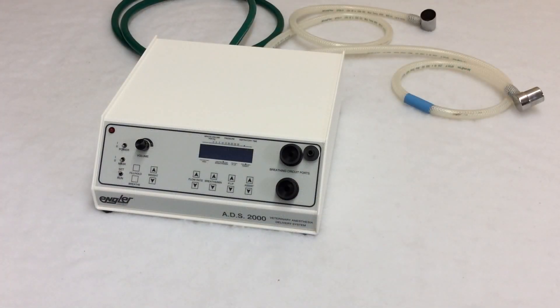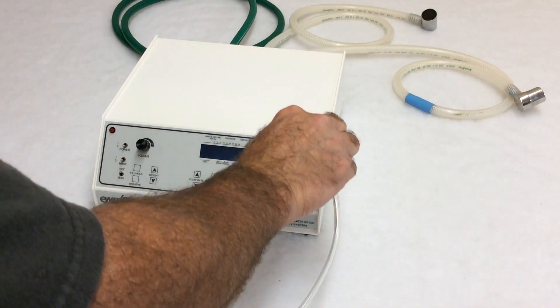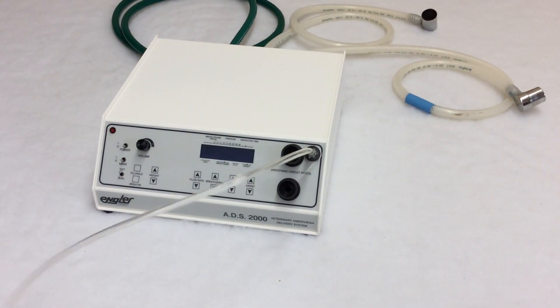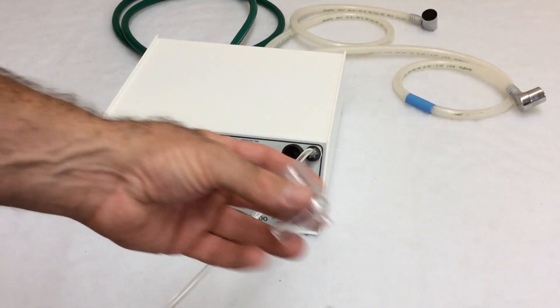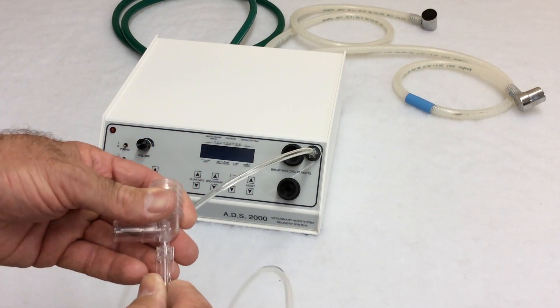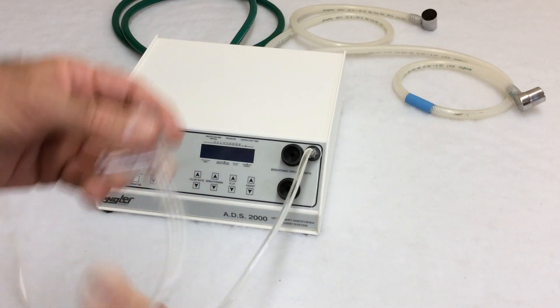Connecting the front of the ADS is just as simple. I'm going to start with the gas sampling hose. We added this hose to better register the breath of small animals and to increase the overall precision when ventilating and delivering anesthesia. That connection goes right here — simple twist on. It connects to the elbow.